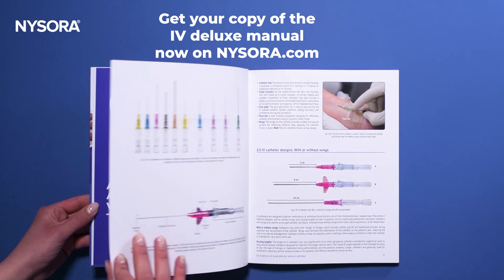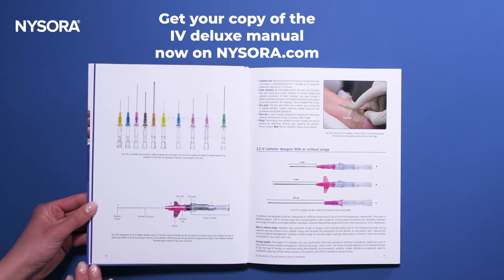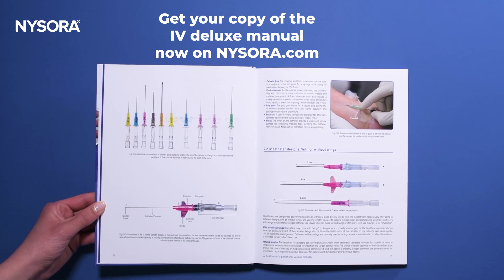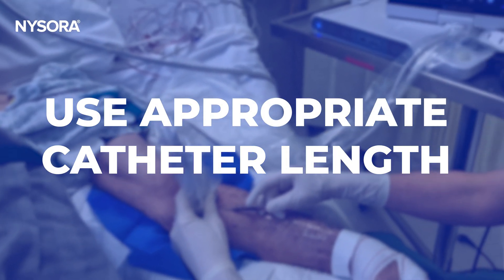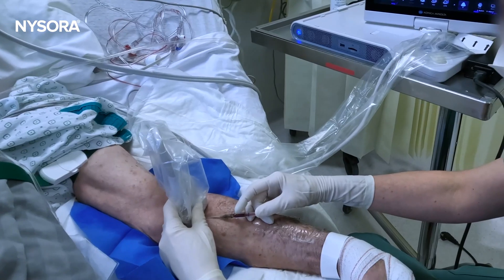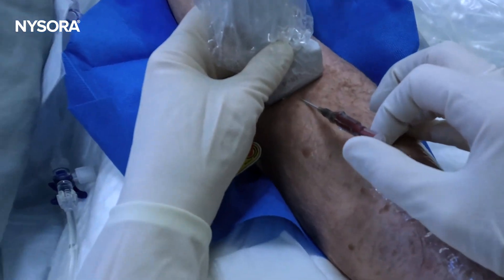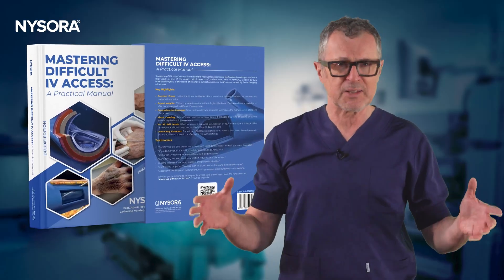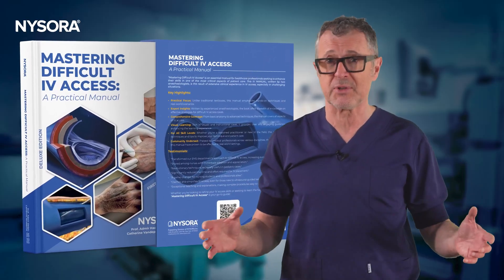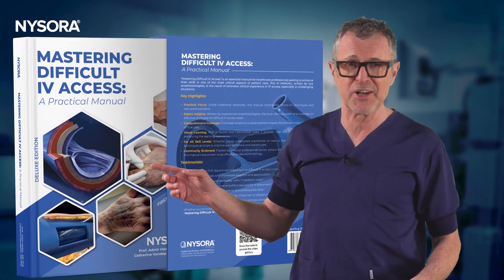Tip number three: use the appropriate catheter length. Don't use overly long catheters that can get caught on valves or smaller tributaries. Reserve long catheters for deeper veins or ultrasound-guided access. Now let's watch a short clinical video that demonstrates these strategies in real time.